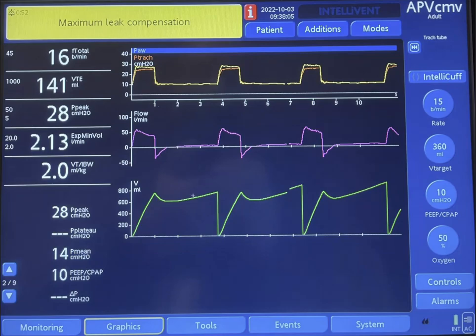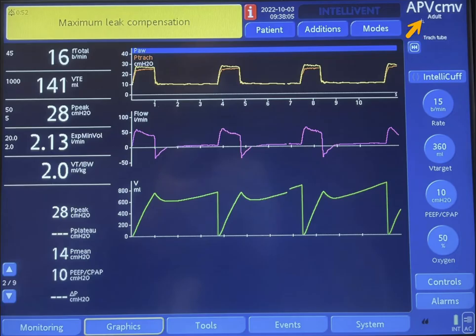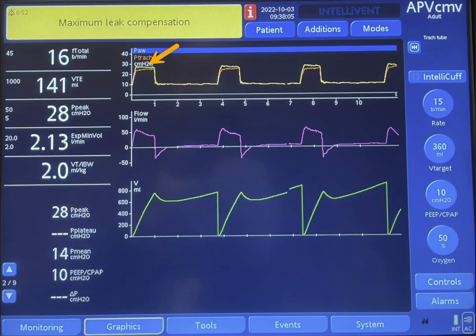Let's take a look at this graphic. First, notice that we have a message stating that maximum leak compensation has been achieved. This is APVcmv mode, and we're targeting a tidal volume of 360 ml. The machine is delivering this with a pressure of 27-28 cm of water.